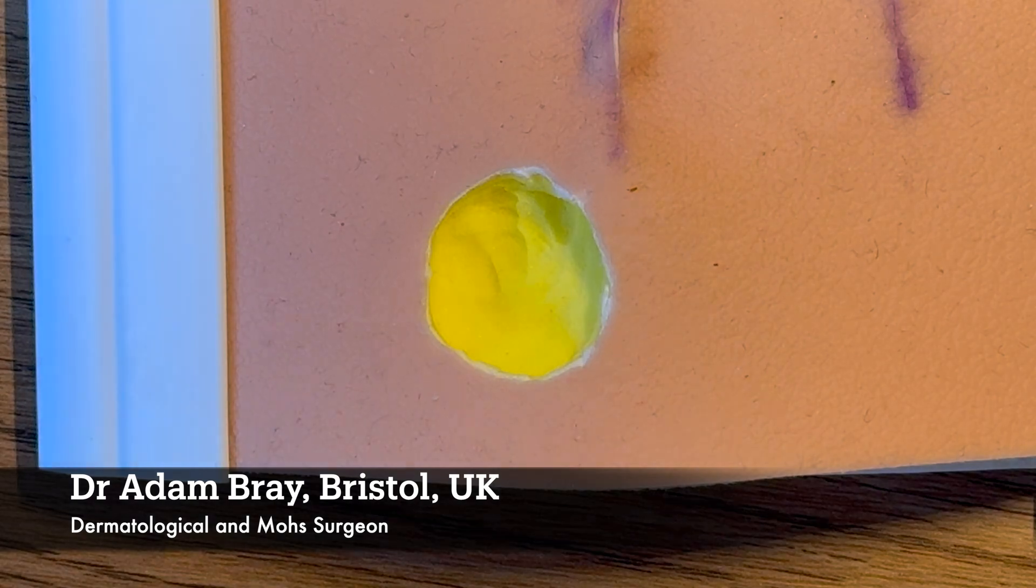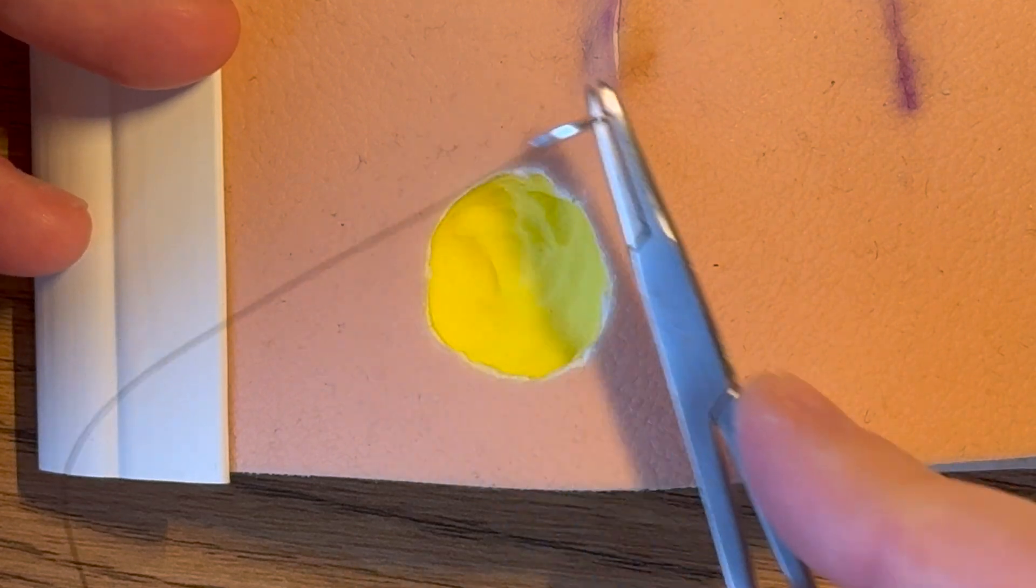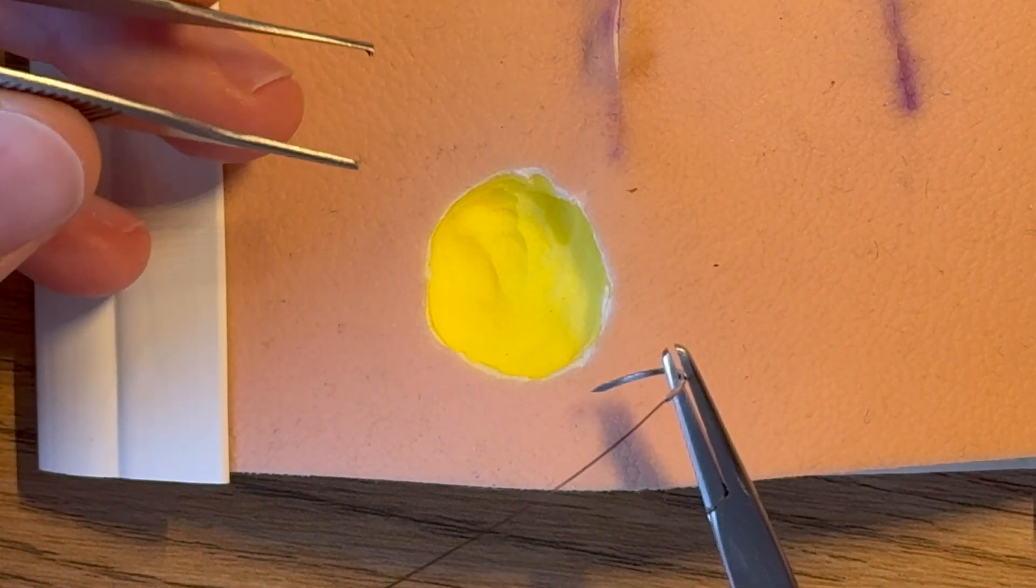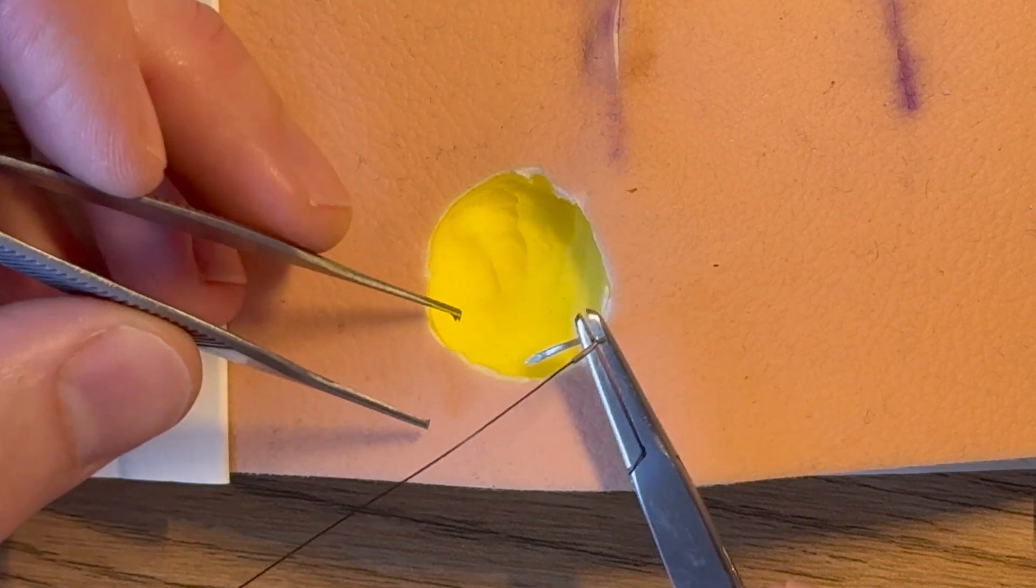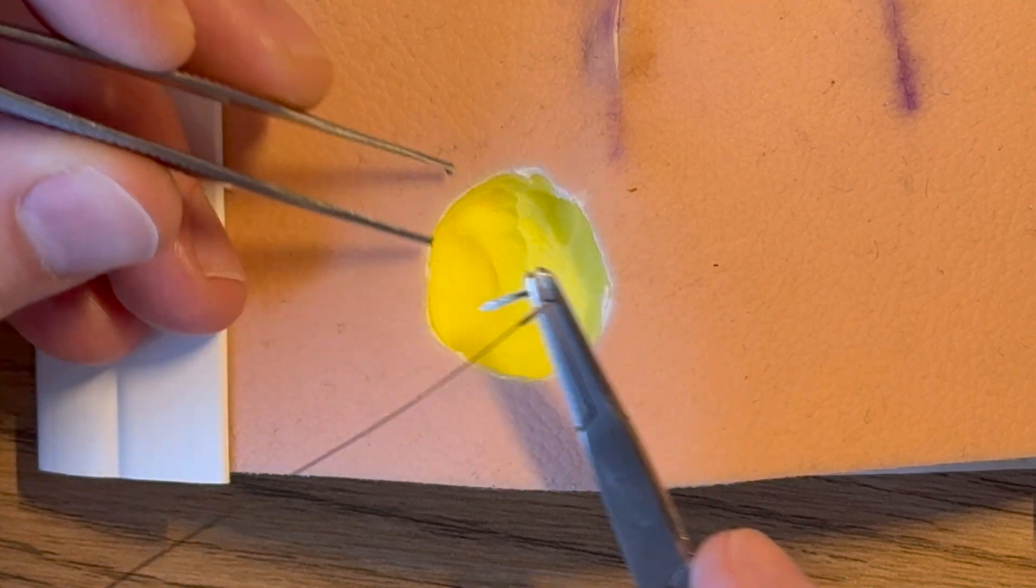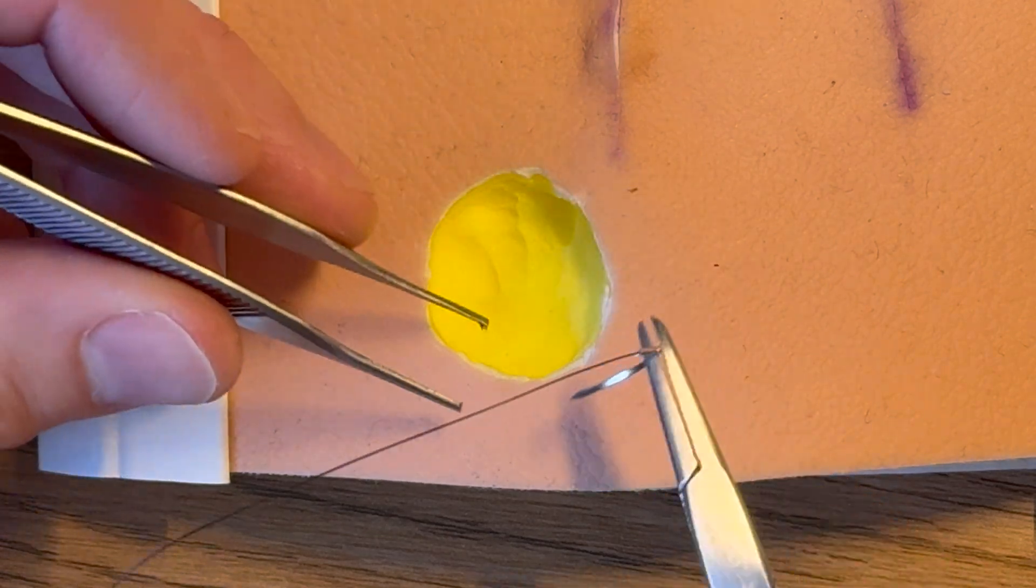If we're doing the fully buried type, we basically want to go around the perimeter of the wound in a very similar way as you would do buried dermal stitches at that sort of level or a subcuticular stitch level, but the more you bury it the better.